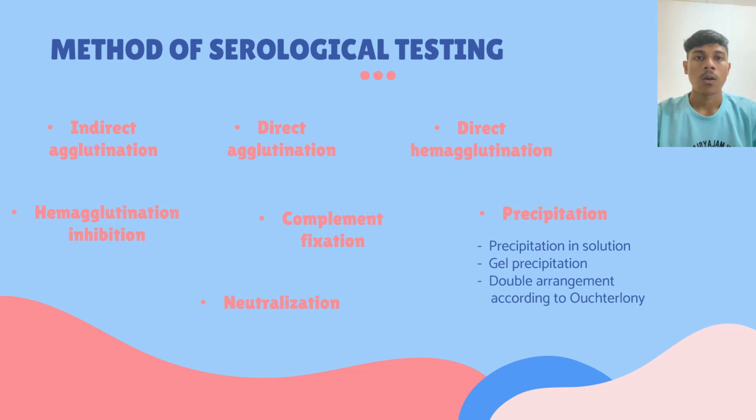Next, complement fixation. Complement fixation reactions are based on complement properties. Free complement lyses erythrocytes and is capable of binding to the antigen-antibody complex. Once complement is bound in the complex, it can no longer disrupt erythrocytes. In a patient blood serum sample, complement must be inactivated by temperature.